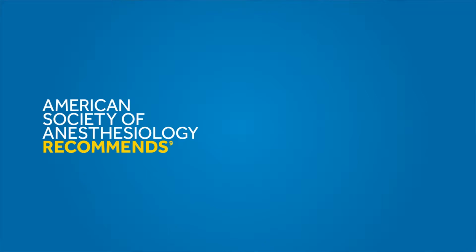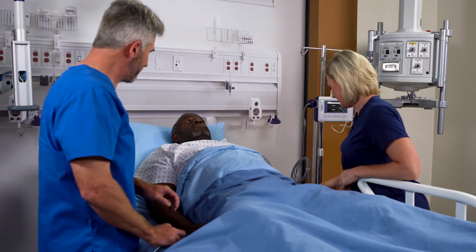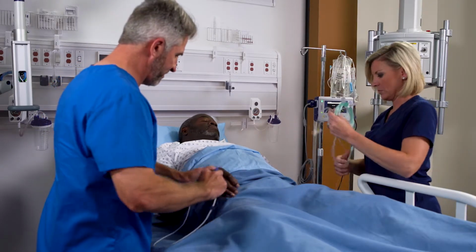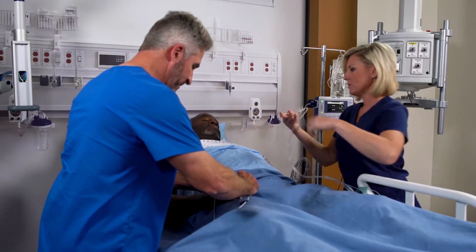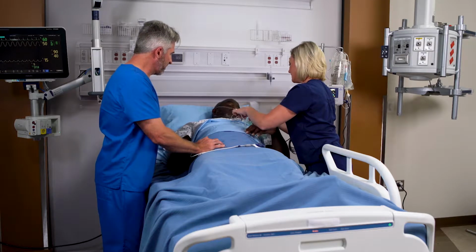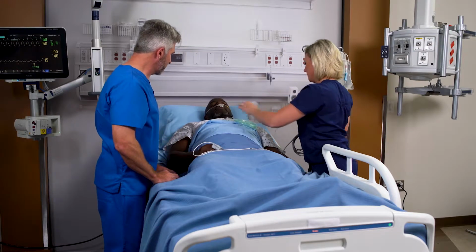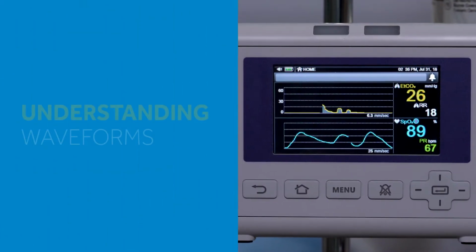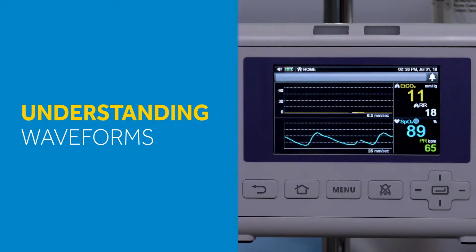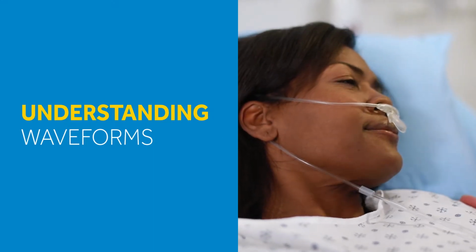And the American Society of Anesthesiology recommends that clinicians should monitor both oxygenation and ventilation during administration of all anesthetics. For patients under moderate to deep sedation, the Society advocates the use of both pulse oximetry and capnography along with visual monitoring. The ASA standards also state that EtCO2 monitoring is required when an endotracheal tube or laryngeal mask is in place. Understanding the changes in the capnography waveforms can assist you in recognizing different clinical situations so you can intervene early and ensure your patient's safety.